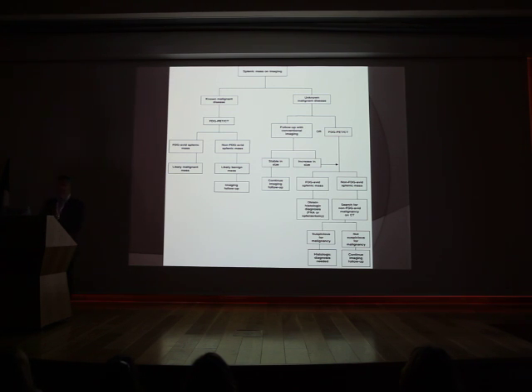Now, if we don't have any malignant disease, we could just follow up, or we could suggest doing a PET-CT. And if the lesion is avid, we should look for other malignancy. Even if we don't know if we have a malignancy, 80% of them, as I mentioned, would have a malignancy. And if we just follow them up and they're not avid, we can still follow up and see if they're stable in size.